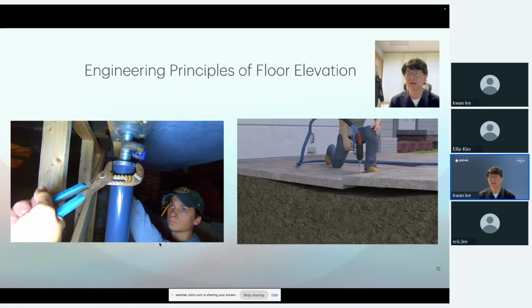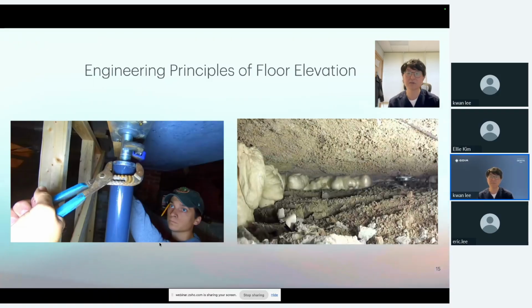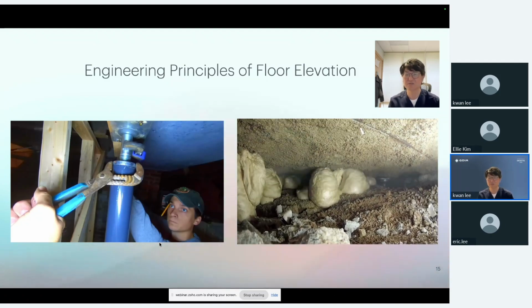But there is the other method we are doing. We're making a small hole as well, same thing, but they're injecting some sort of hydrofluidic medium, such as gel or saline, and that material goes inside a closed chamber and creates pressure.